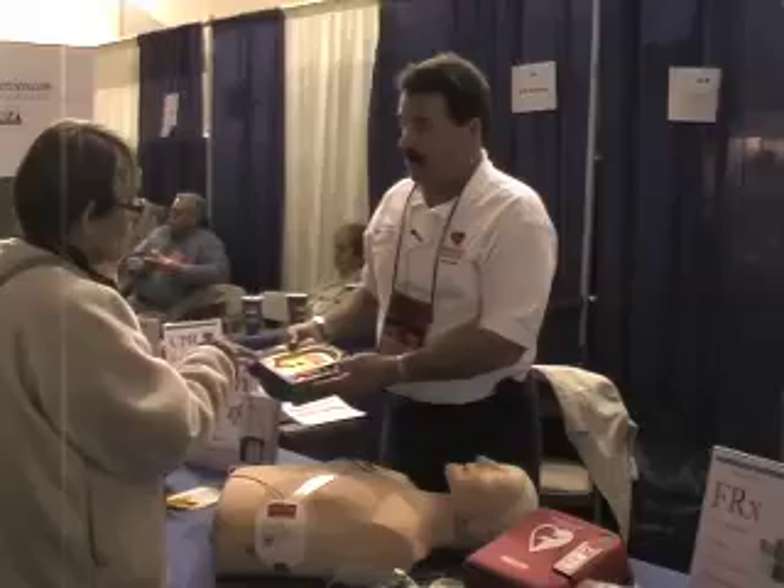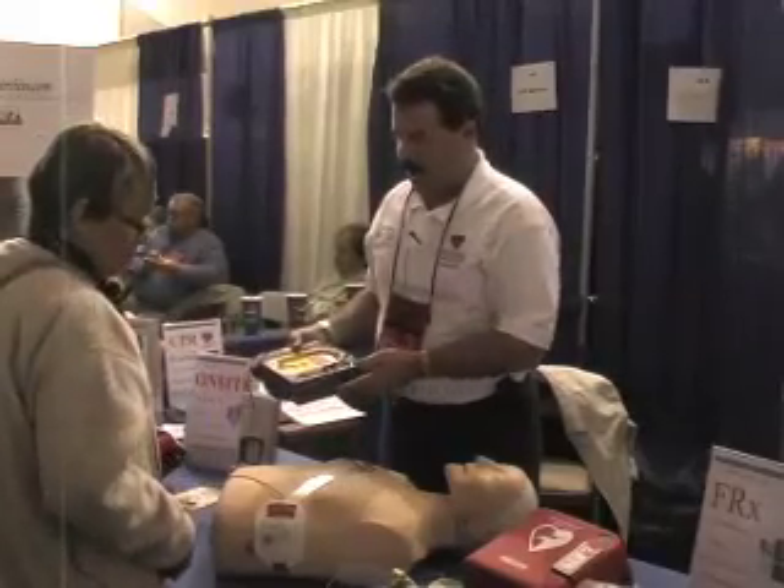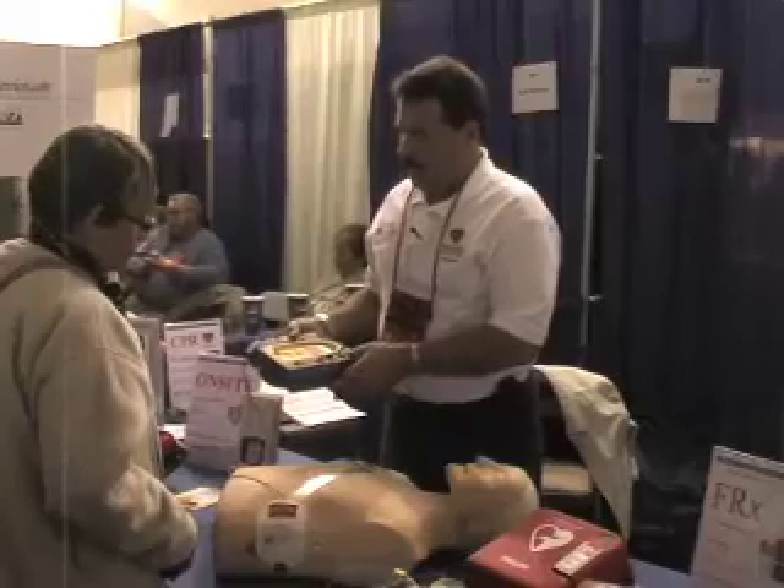It's now telling you shock advised. You push the orange button — it delivers the shock. No one can touch the patient.